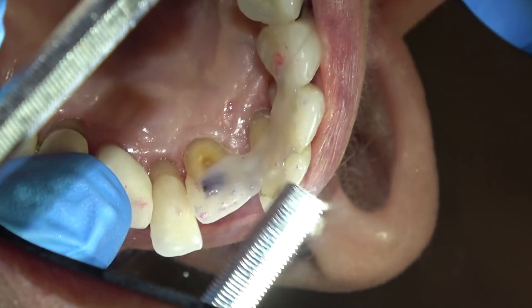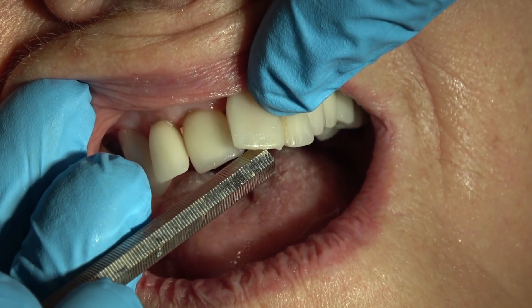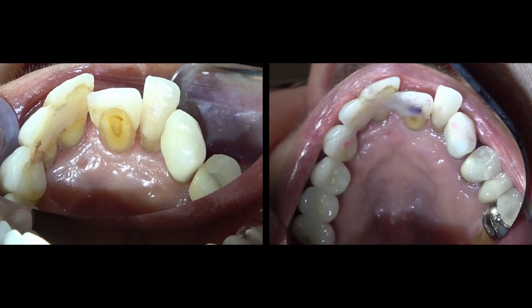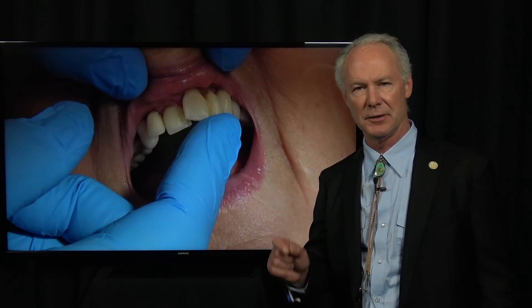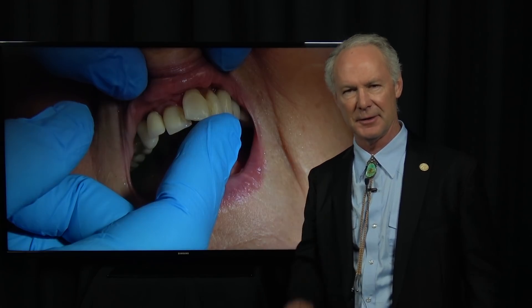I'm checking the stability of the teeth — they're immobile now, they don't move. Good and solid. So that's a quick way to stabilize teeth in a very compromised situation when you want to do something fairly simple. And that's the Dental Minute.